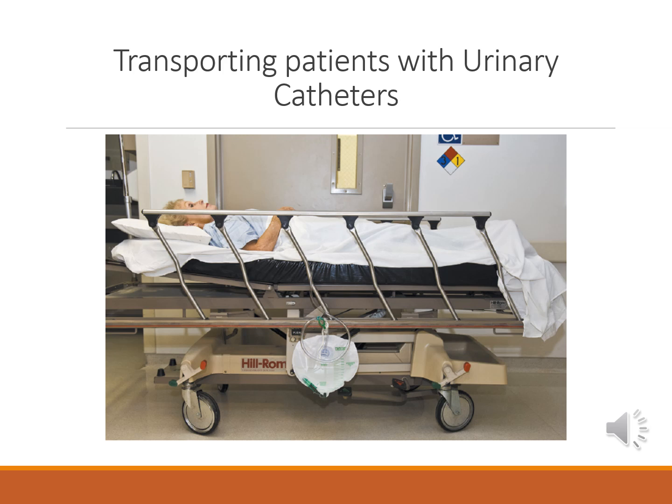For patients in a wheelchair, attach the drainage bag to the underside of the chair, ensuring that the tubing is coiled at the level of the hip and does not touch the floor or become tangled within the wheels. The bag should never be placed on the patient's lap or abdomen to avoid urine reflux into the bladder. Always avoid disconnecting the catheter from its closed drainage system to prevent infections. If disconnection does occur accidentally, a new catheter and drainage system must be used. Technologists should not disconnect the catheter or empty the bag without being told to do so, and should consult with a nurse for guidance on monitoring urine output for laboratory testing.